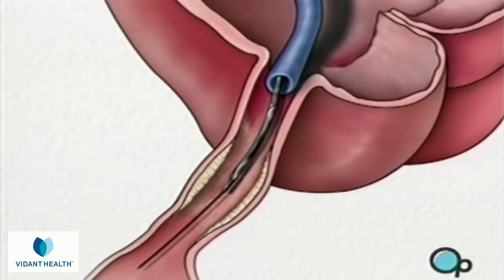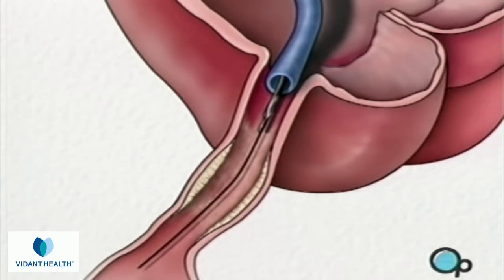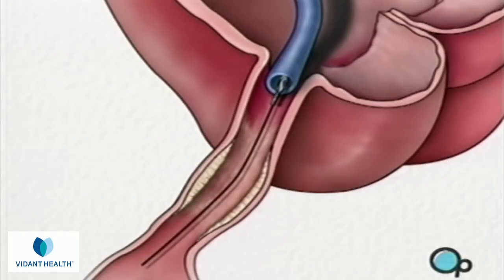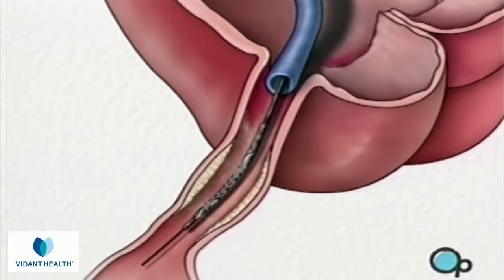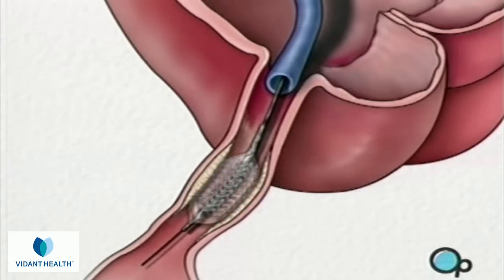The balloon catheter is then withdrawn and another balloon catheter is inserted. This balloon has the mesh stent tube wrapped around it. Once this tube has been placed in the center of the now widened area of the artery, the balloon is briefly inflated. The stent expands until it hugs the walls of the artery.